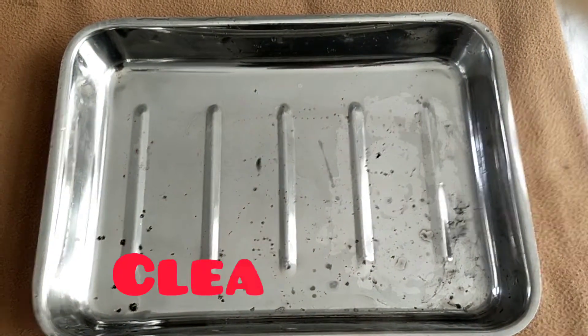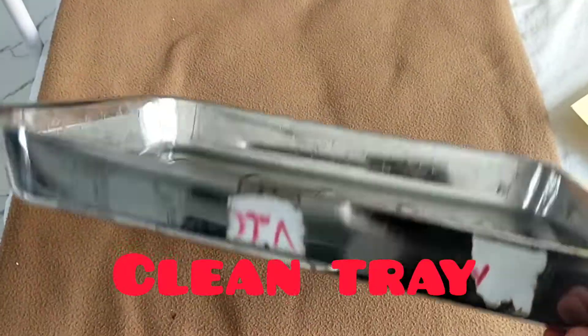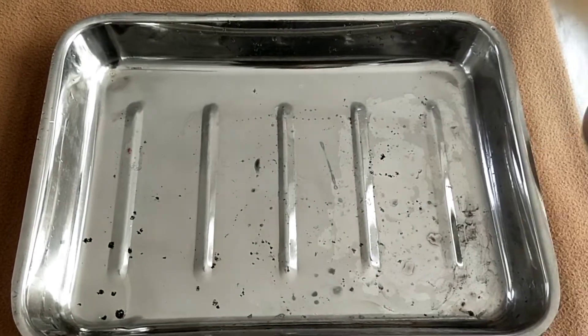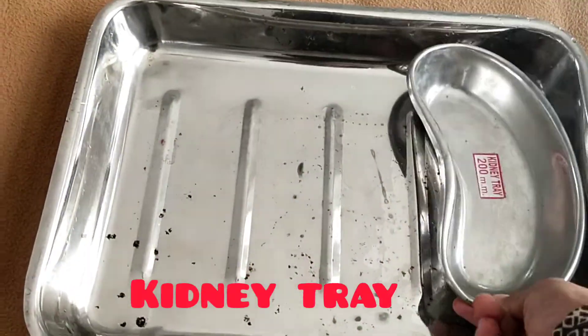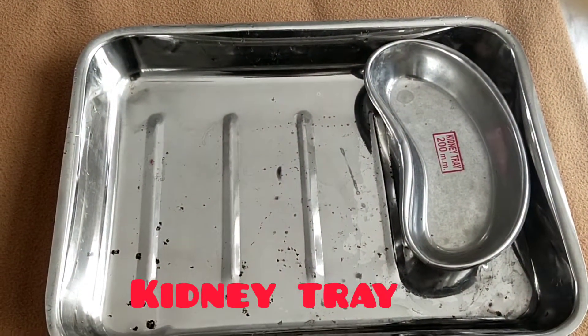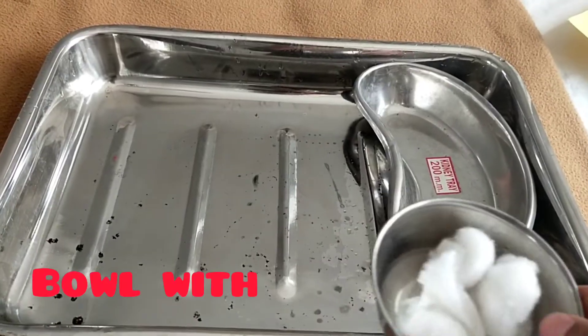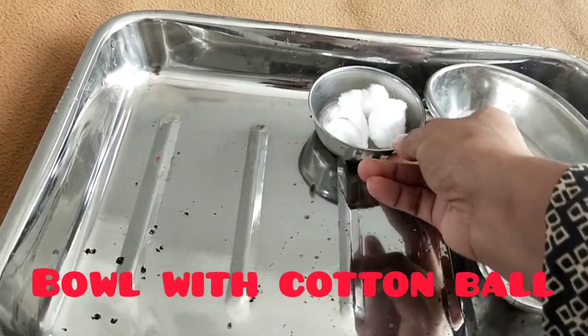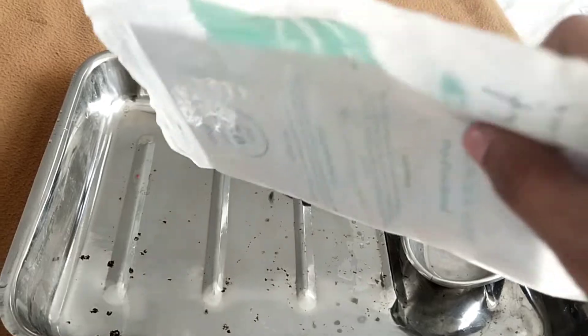First, I take a tray — this is a tray. Next, I take a kidney tray — this is a kidney tray. If a kidney tray is not available, then you have to make a paper bag. Next, I take a bowl with cotton.